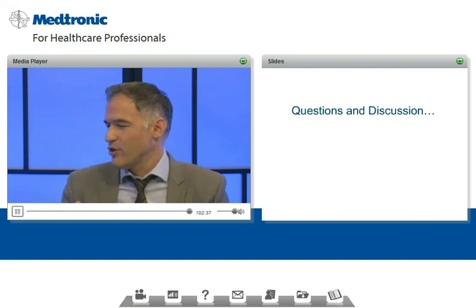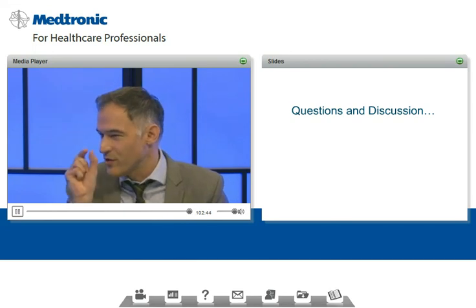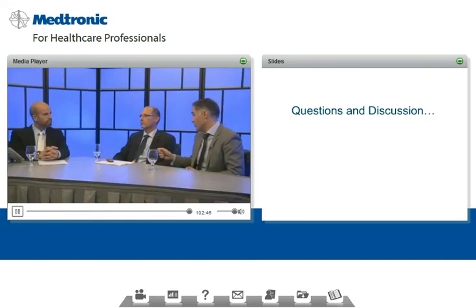But arguing between 4 hours and 5 hours, I'm not sure we're going to benefit our patients so much by that degree. The concept is already such a good one. I think the difference of an hour or two is not going to make the world of difference. Yeah, it's a matter of priority. It's maybe an academic question, but from a practical point of view, the active insulin time is a very small contribution to big issues in control, I would say.